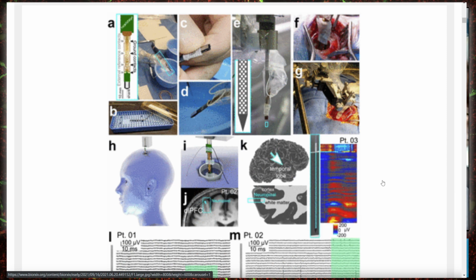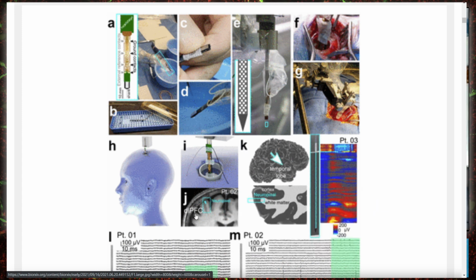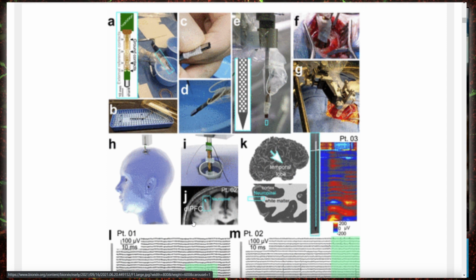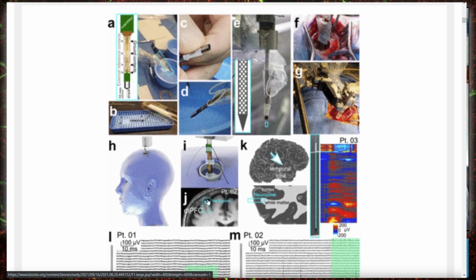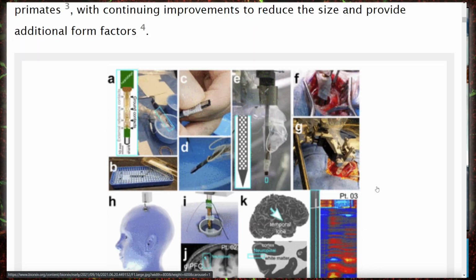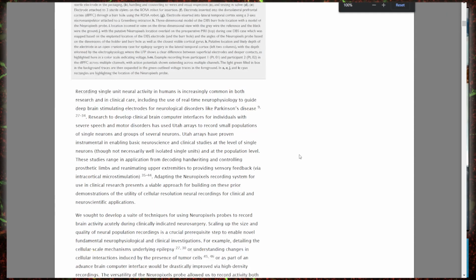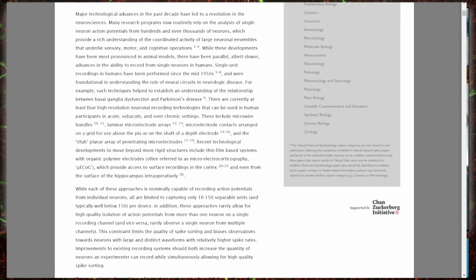Is that how they put it in? Why would they put it in the prefrontal? That's a weird position. At least I'm seeing something like DPFC here. Checking the image, DLPFC, so dorsolateral prefrontal cortex, presumably. Yes. Again, I don't know why or how, because that's a very uncharacteristic brain area to do deep brain stimulation or to lesion. That's weird. Maybe it's a tumor or something.